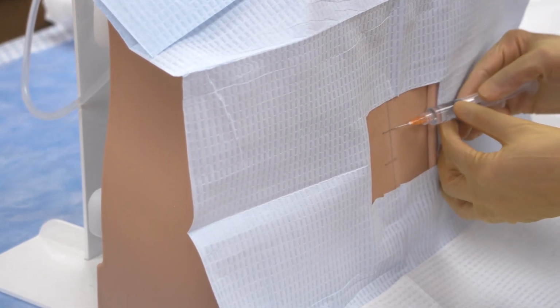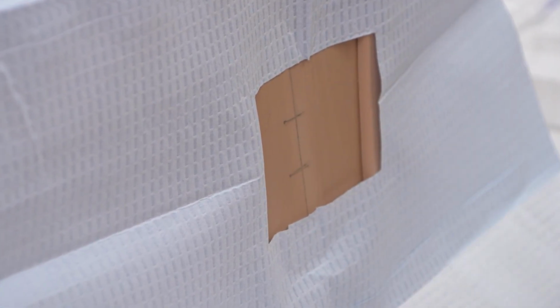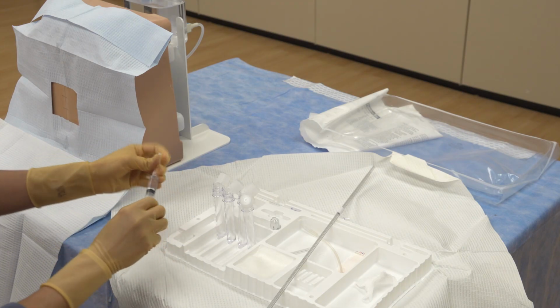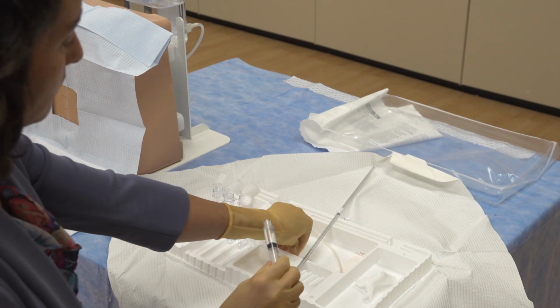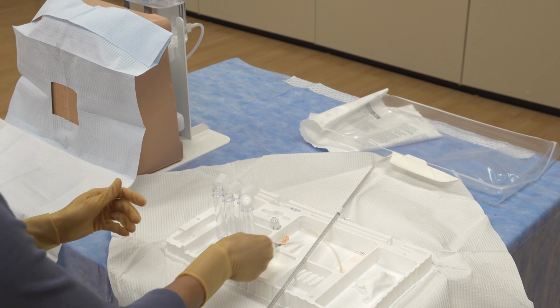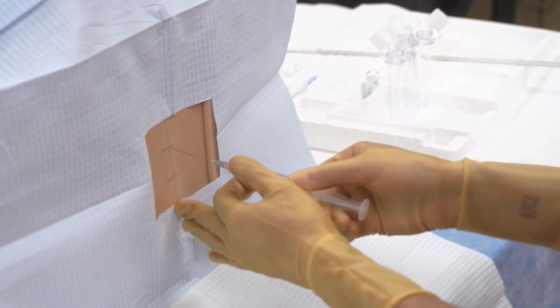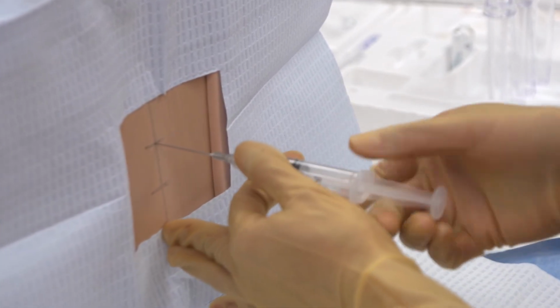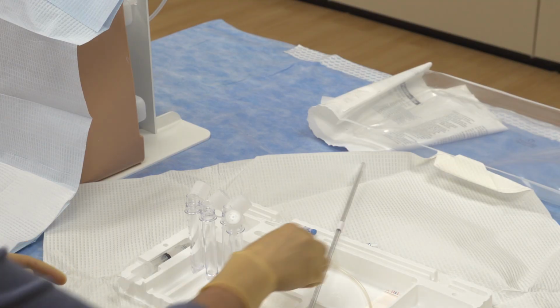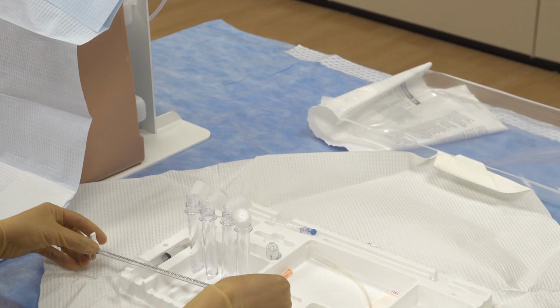Create a skin wheal using a 25 gauge needle. Exchange the needle now to a 22 gauge needle to further anesthetize the deeper tissue, ensuring to aspirate before administration of any lidocaine to avoid accidental intravascular administration. It is not uncommon to encounter stiff resistance as you traverse the supraspinous and interspinous ligaments. To reproduce the dural depth from your pre-procedural measurement on your spinal needle, you can use the centimeter markings on the manometer.